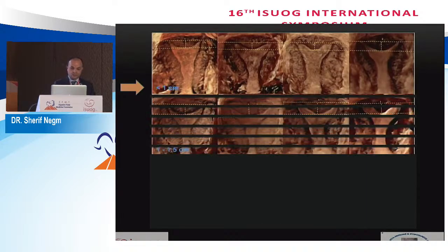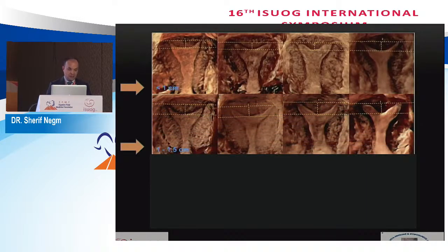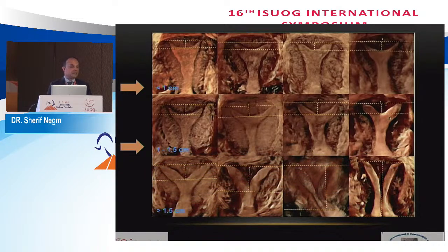You can see here from the slide from their article, all the uteri in this slide were considered to be partial septate uterus using the ESHRE/ESGE classification system, while here you can see that the top two rows are actually considered to be normal if we use the American Fertility Society or American Society for Reproductive Medicine classification.